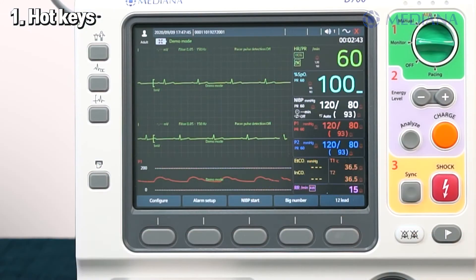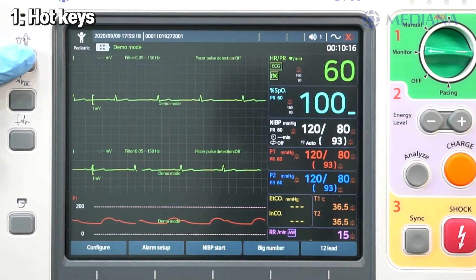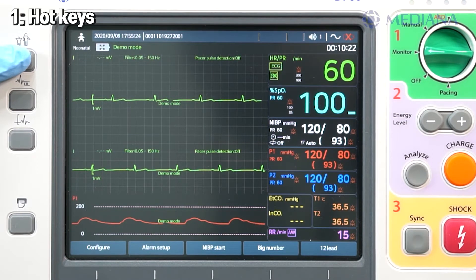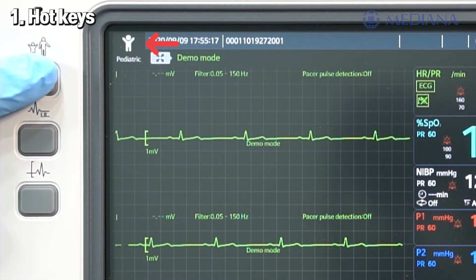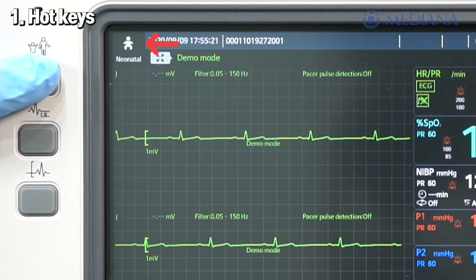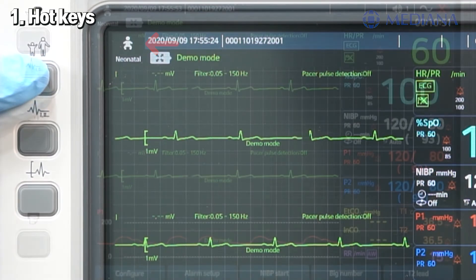On the left, there are hotkeys. The main purpose of the hotkeys is to provide users convenience. There is a patient type button which can switch patient mode from adult, pediatric, and neonatal. It also changes alarm limits and energy settings when changing the mode from pediatric to adult mode and vice versa for defibrillation and AED mode.